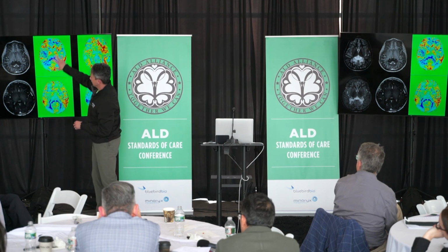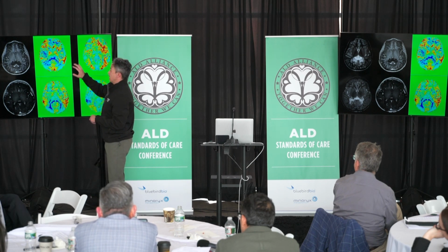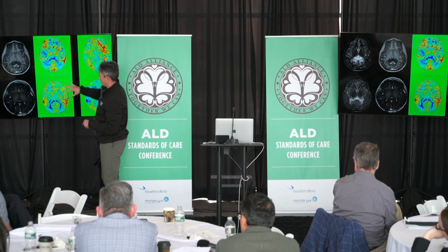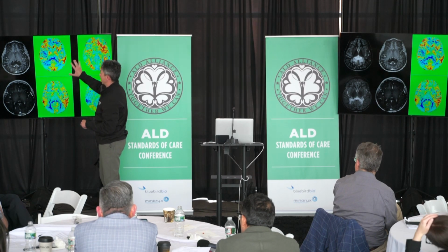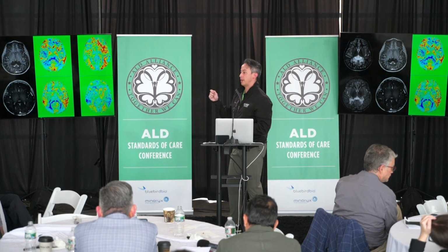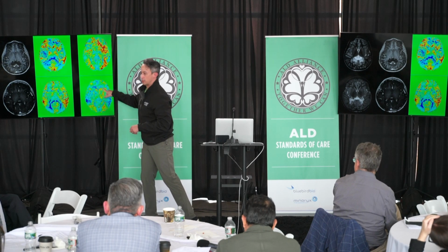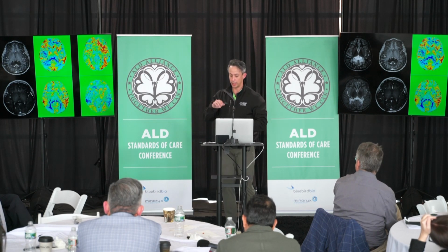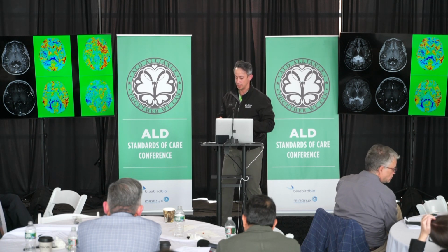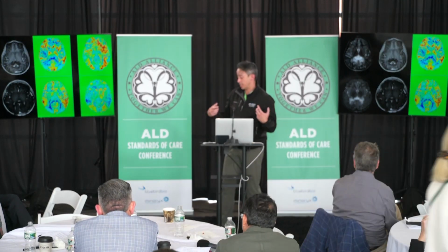This column is the QSM negative map. This is the myelin map. QSM positive, so this is the iron. But I just want to focus and draw the point that if the brains match the controls, everything would be sort of this green-yellow color in the middle. And I changed the coloration for the next slide just to make it easier. But I'm going to walk you through what I think we're seeing.